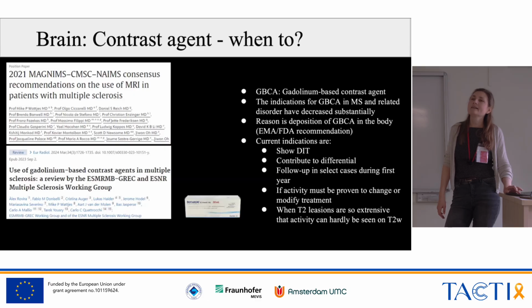If the motivation for contrast agent is mainly that you can just not deal with the vast number of lesions, do you use any processing software? I mean, it could be software processing. Yeah, there are many computer-assisted software devices for automatic detection. Some of them are reasonable, some are not reasonable. Do we use them in Amsterdam? Currently not yet. Will it come? For sure.